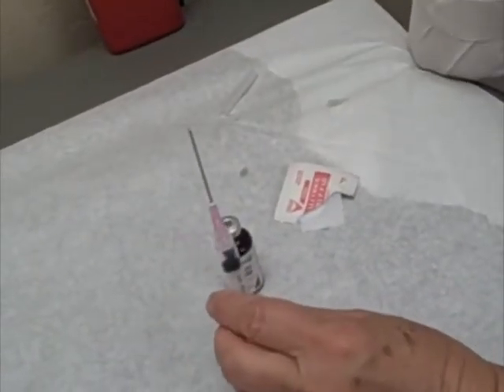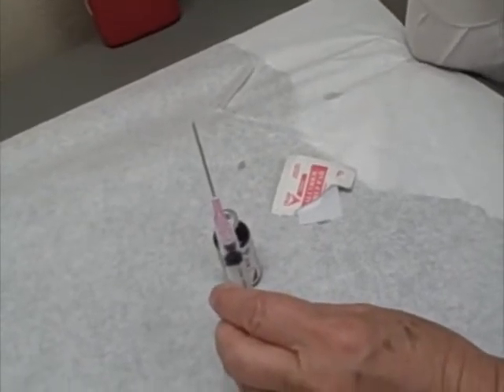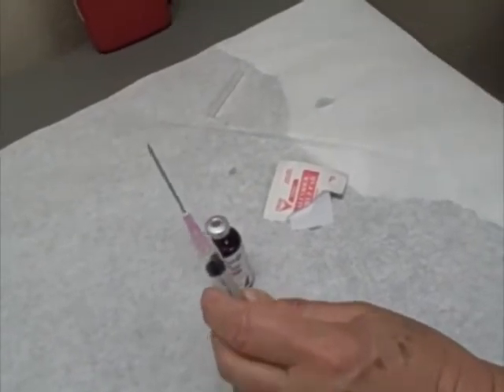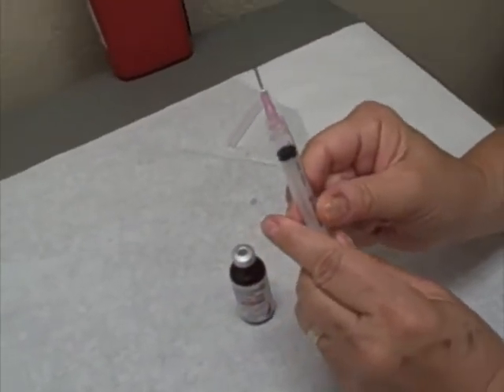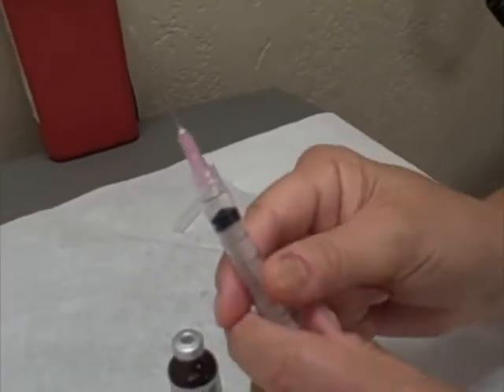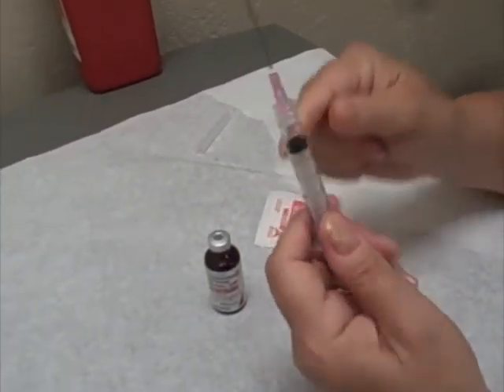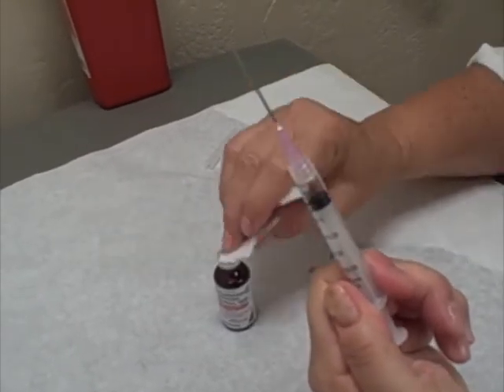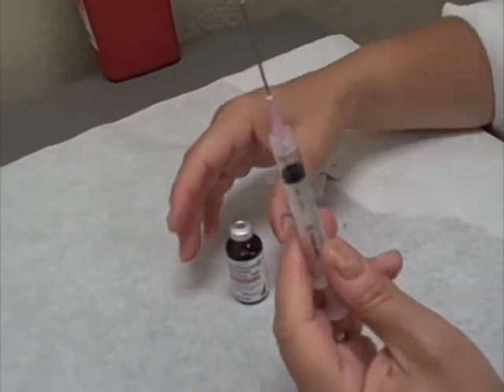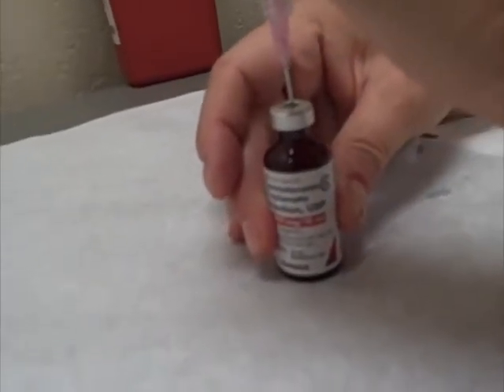The technique for drawing up the testosterone is almost the same as the B12, and I'm going to demonstrate it for you. You draw up the air the same way you do the B12 in the same amount of the dose you're going to give. And here it's half a cc, and notice that again I'm lining up the bottom of the plunger with the numeral on the barrel. Then you clean your bottle and inject the testosterone into the bottle.